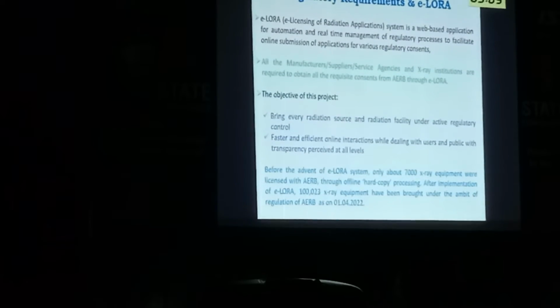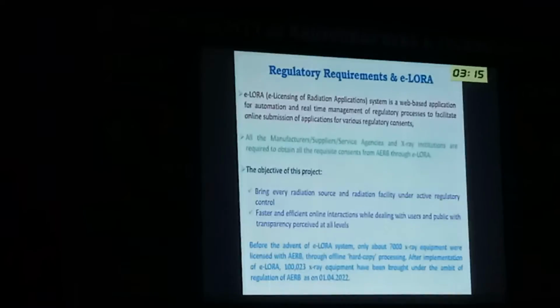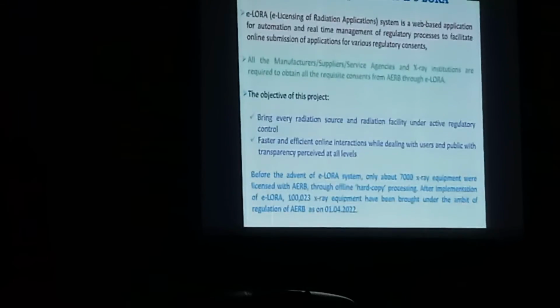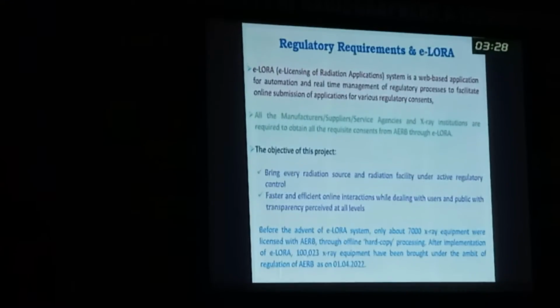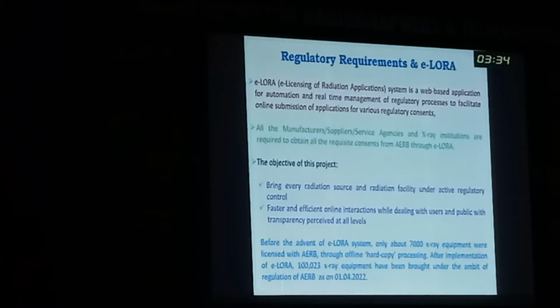So regarding regulatory requirements, AERB has launched eLORA, we are all familiar with this, e-licensing of radiation applications. All the manufacturers, suppliers, service agencies and X-ray institutions are required to obtain all the requisite consents from AERB through this eLORA. It helps bring every radiation source and radiation facility under active regulatory control, with faster and efficient online interaction while dealing with users.